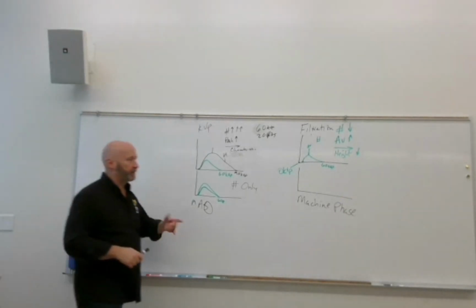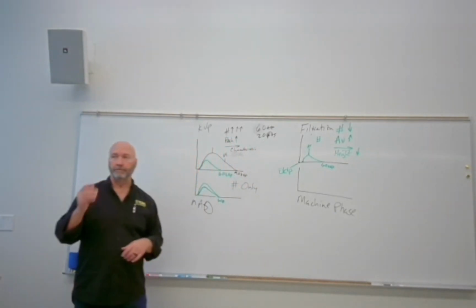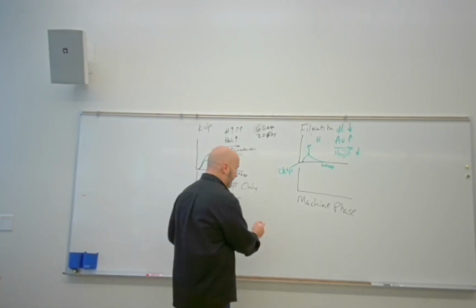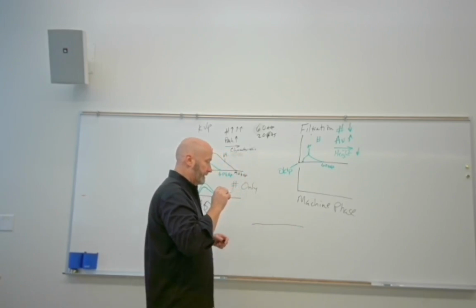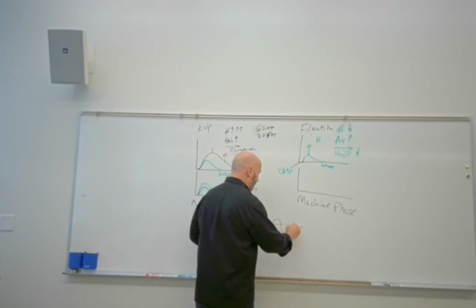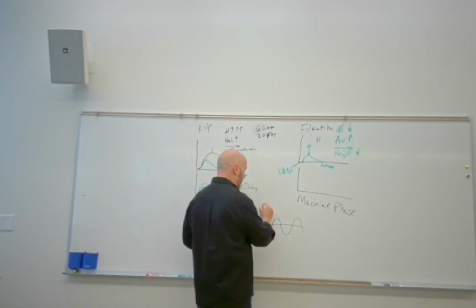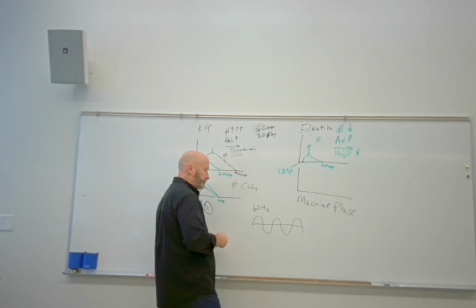Machine phase: you're going to have a tendency to confuse machine phase and filtration. You're going to have a tendency to flip them about. With machine phase, what we're talking about is going from single phase, three phase to high frequency. With an unrectified single phase X-ray machine, what we get is these pulses at 60 hertz, 60 cycles per second.